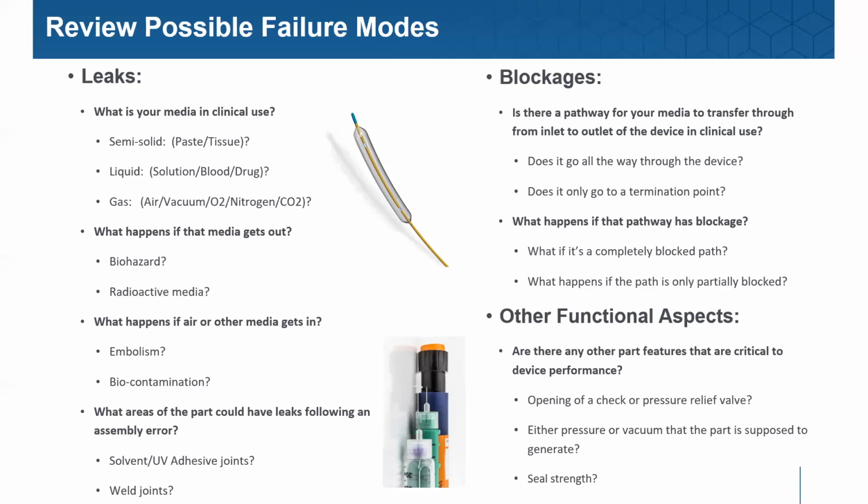But in any case, when we're normally testing before the device is being filled with some media, we have sister companies who actually specialize in post-filling operations testing that do an excellent job and specialize in filled container testing. But for us, it's primarily going to be for things like IV bags and blood bags. We're testing them before they're being filled. Got it.